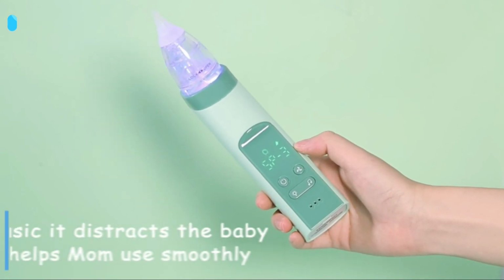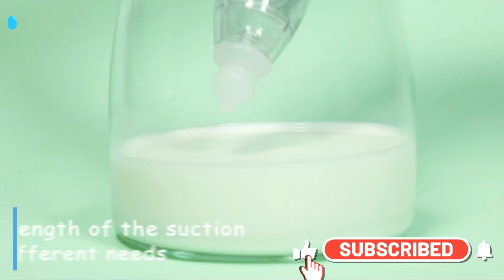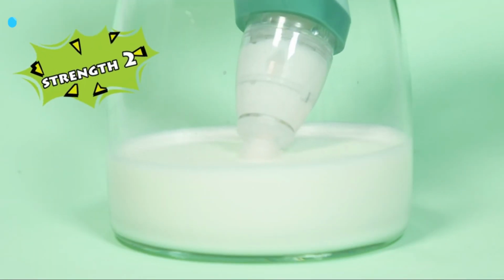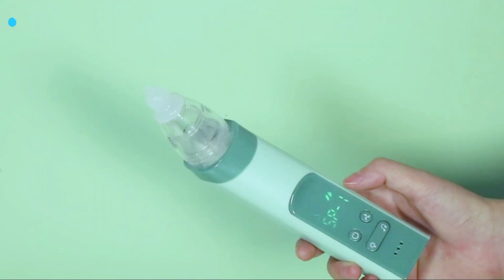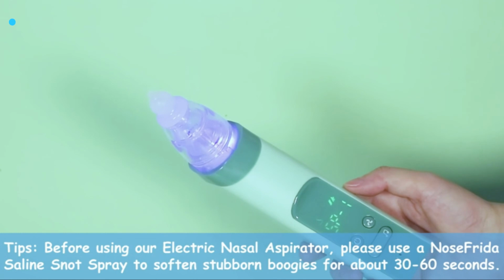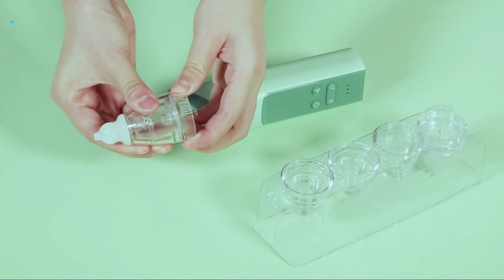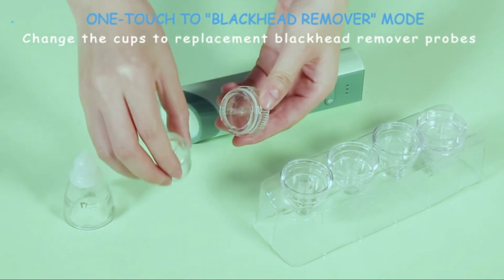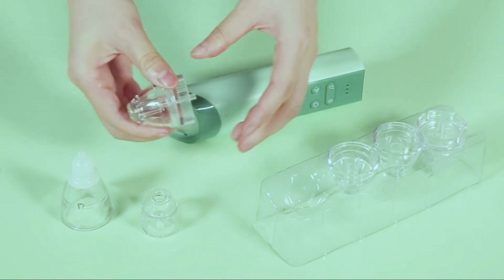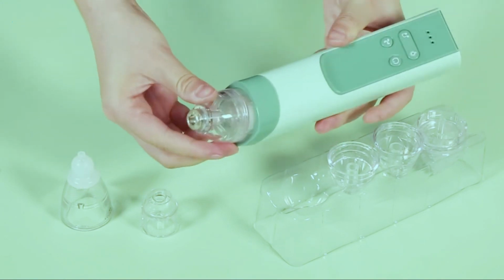Over here on the right, you'll see a light button. If you press that, the device will produce an ambient light to relax your baby as well as draw their attention. To turn it off, simply press it again. Over here on the left, you'll see a musical note, and if you press that, it'll play some music for your baby's attention as well. And of course, if you want, you can have them both going at the same time. Simply turn the device off, press the power button one more time.